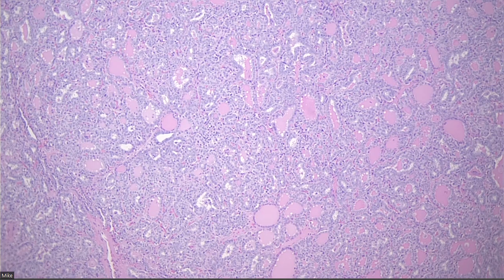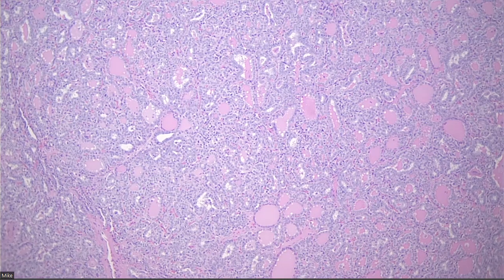But what's the thing going against it for her? It was 4 centimeters. The bigger something gets, the more they start to worry. This is why I'm really cautious with these things, especially if they are not BRAF positive and not RAS positive. It's all these ones in the middle where every single tick mark you get buys you something or doesn't, because it's not a linear on-off switch. They take every single thing into consideration. Because this was bigger, I think the risk for her was probably worse, and I think they probably did do a completion on her.